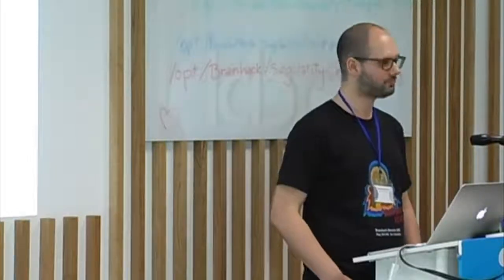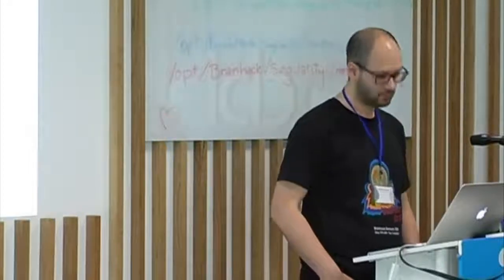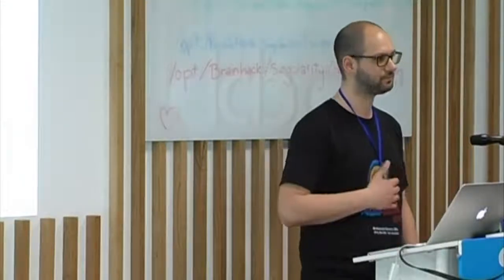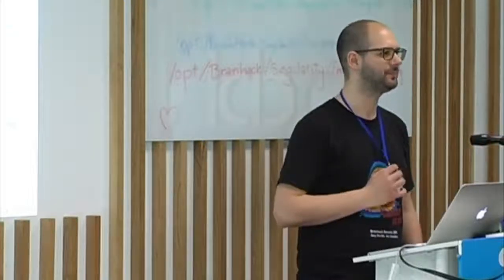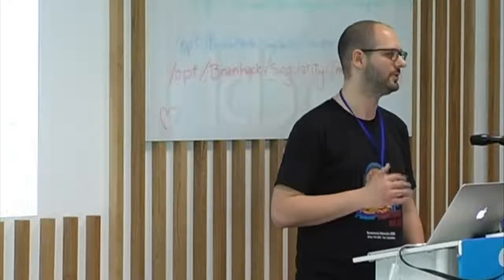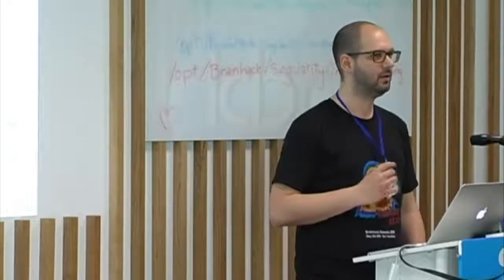And my second question is, you have talked about the asymmetry approach. What about the ball and rackets model? Has that been implemented in FSL somehow, or is it just too complex? It takes a very long time because of the number of parameters that you need to estimate. You definitely need a GPU to be able to estimate that. Is it available?